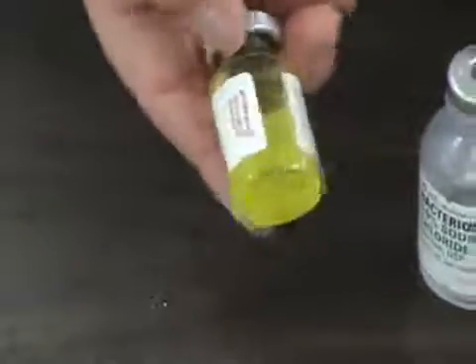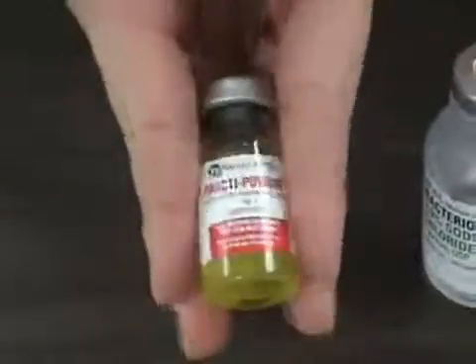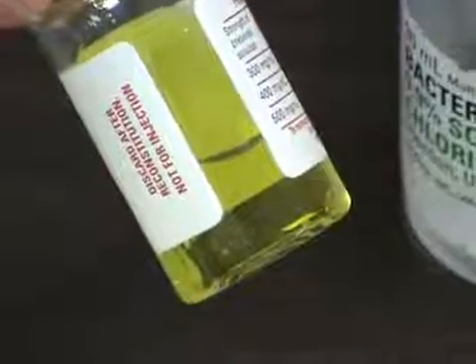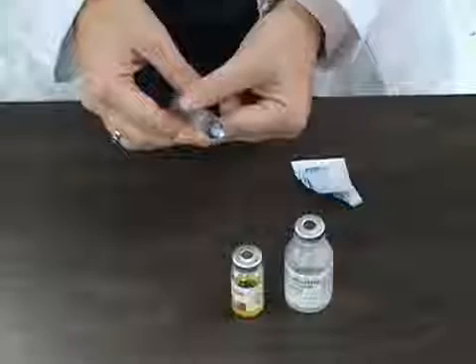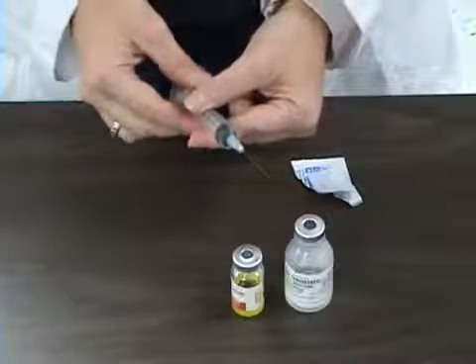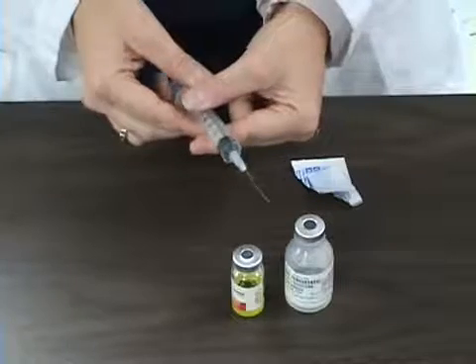I want to gently agitate the vial so that all of the medication has dissolved in the diluent. Now the medication is completely dissolved. Now I will draw out the dose of 500 milligrams, which is 1 ml.